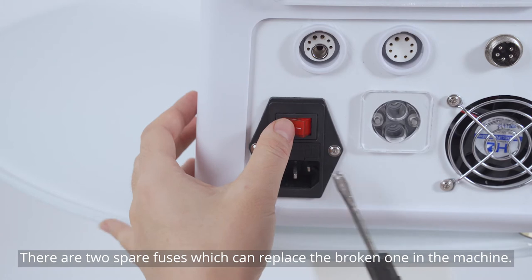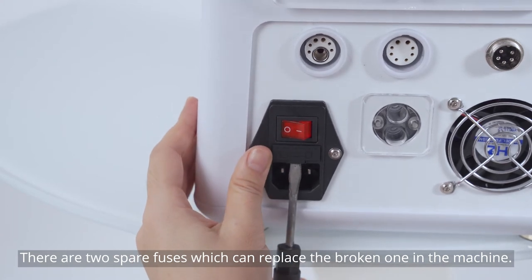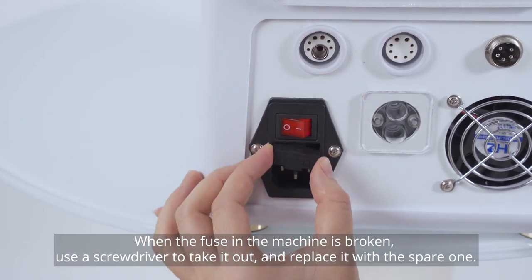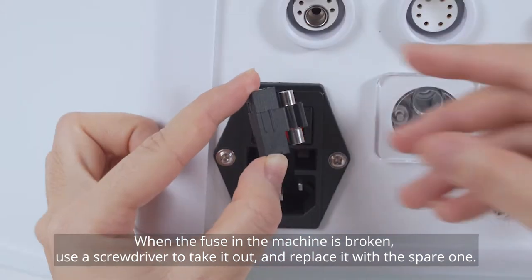There are two spare fuses which can replace the broken one in the machine. When the fuse in the machine is broken, use the screwdriver to take it out and replace it with the spare one.